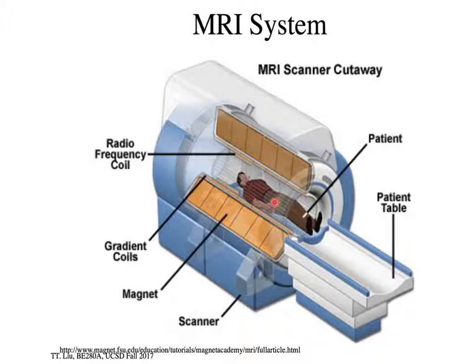at 1.5 Tesla. And then inside the magnetic field coils are another set of coils, 3 independent coils that we looked at that are called gradient coils, which change the magnetic field as a function of position. It's important to note that they change the amplitude of the Z magnetic field. It's not that they make a magnetic field in the X and the Y direction. They just change the actual amplitude of the Z field as a function of X and Y.